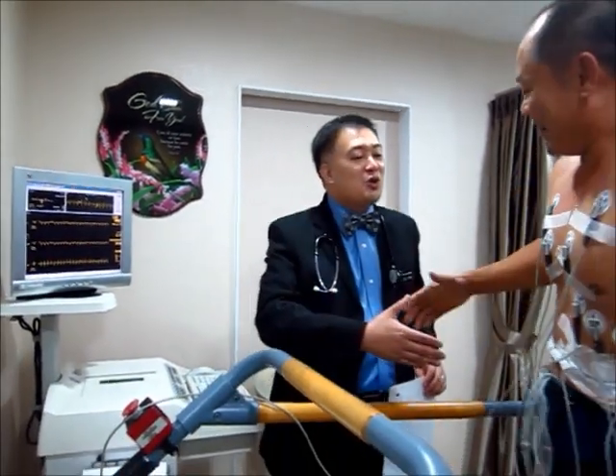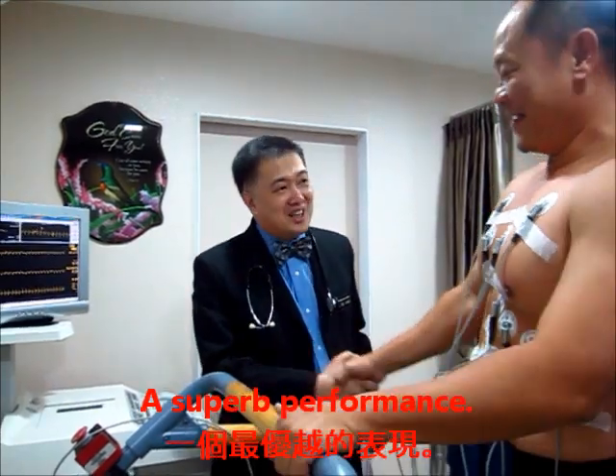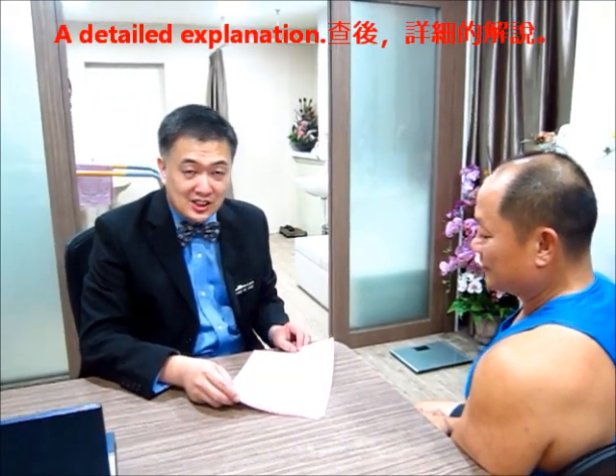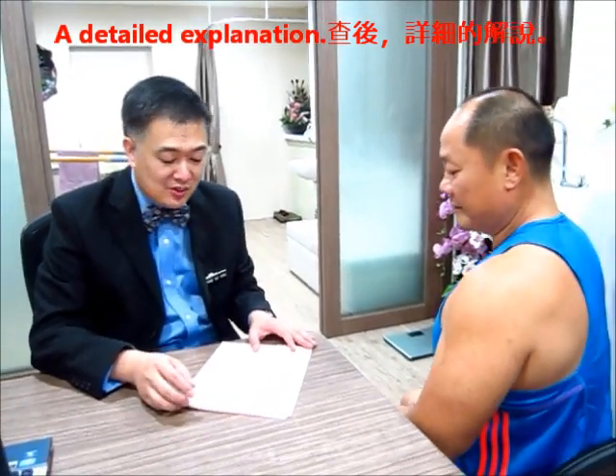Mr. Koh, I wish you all the best — this is indeed a great test and a superb performance. What I normally do after the test is sit down with the patient and go through the test results with them, reviewing each stage and the ECG readings together.